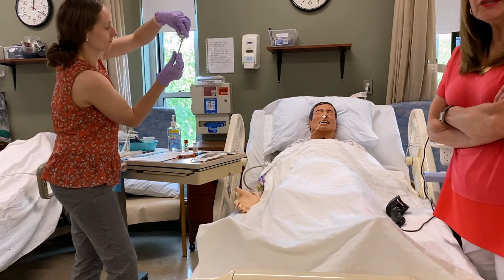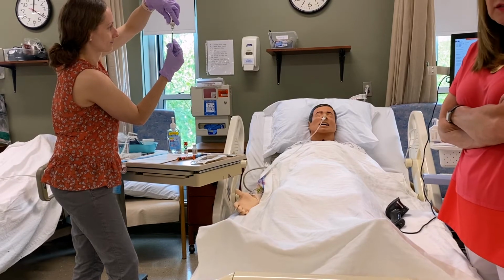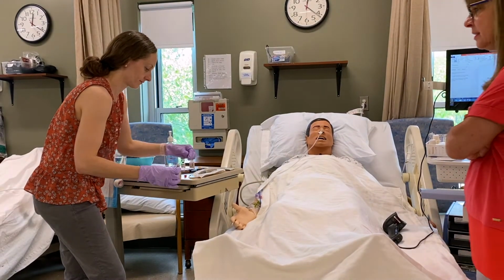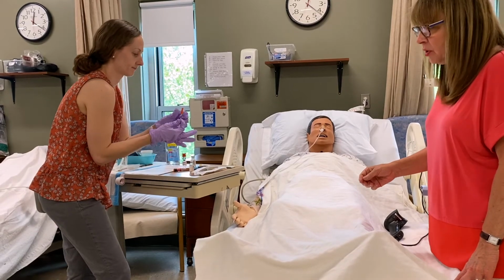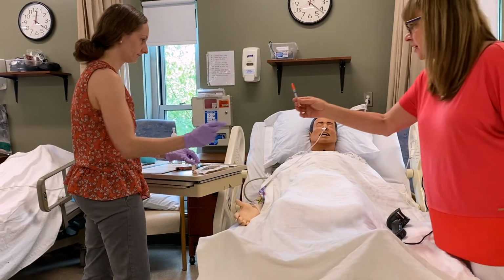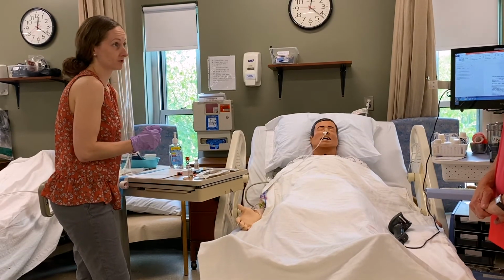If the syringe leaves the medication room, it needs to be labeled. That's a Joint Commission standard, even though the vial is with you, because you need to scan it. And what she's doing is capping on the table instead of doing this. Very good. 8 units, perfect. And where can you give this to this patient? So this is going to be subcutaneous.